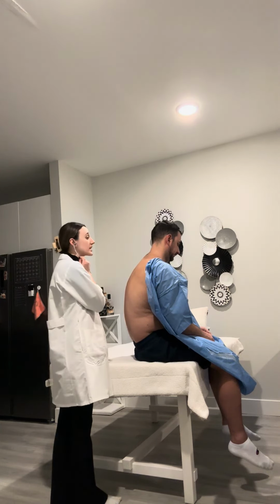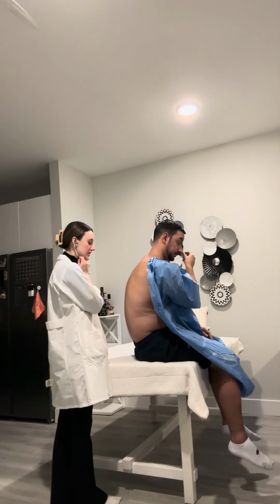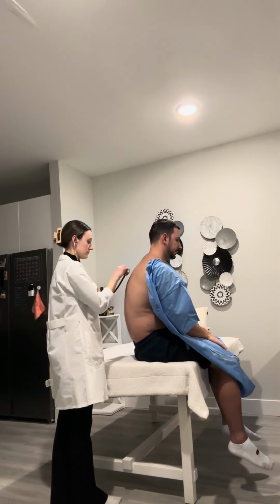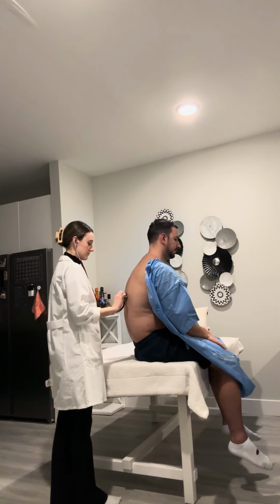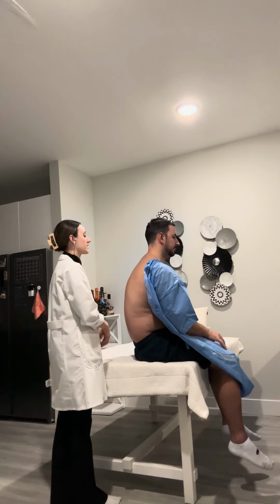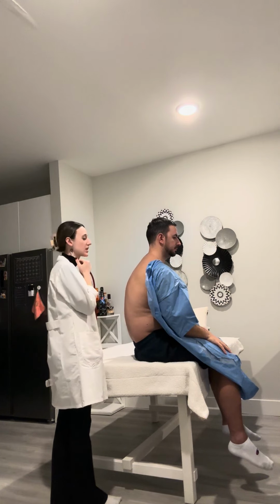Now I'm going to perform egophony. So you're going to say the letter E every time I move my stethoscope. E, E, E, E. Okay, very good. So E was not heard as A. There's no signs of consolidation.